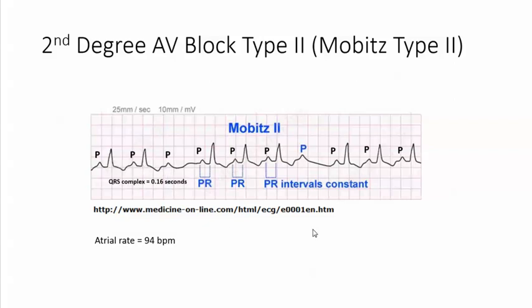So then look at the PRI. The PRI is 0.2 seconds, which is normal, and they are constant.